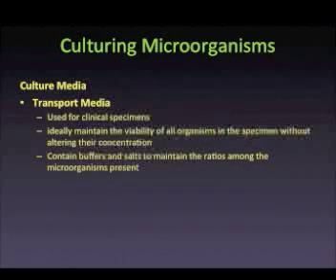Transport media are media that contain salts and buffers necessary to keep the organisms alive and maintain their ratios for a short period of time until they can be transported to the lab for identification. Hospital personnel are responsible for properly taking the sample and for using the proper transport media. Both aerobic and anaerobic transport media are available for clinical specimens.